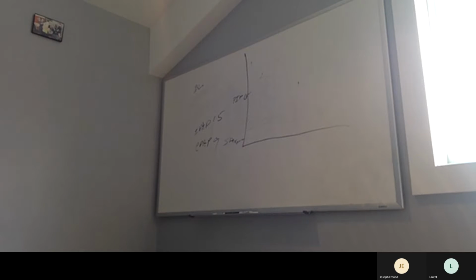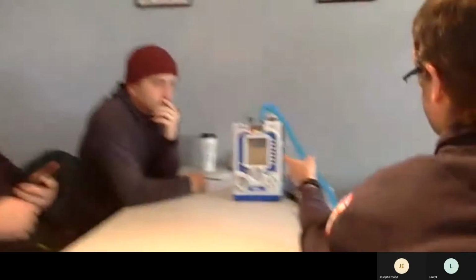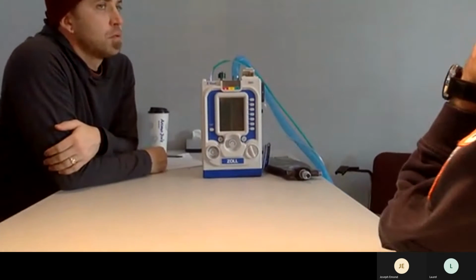Sound good? Right. On this top left of the screen, though, it didn't give BL as an option. No, you have CPAP mode. Oh, so right directly in that box as opposed to up here. Correct. So you start there, and then you change your percentage.